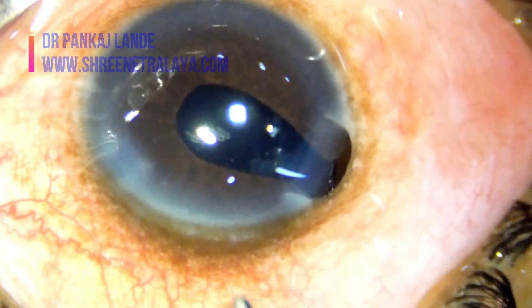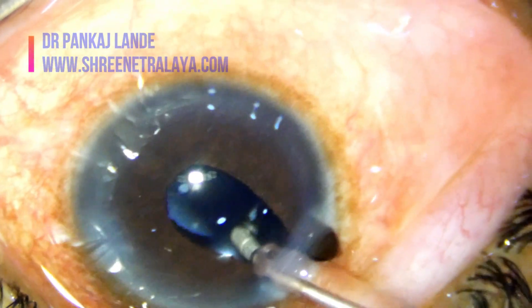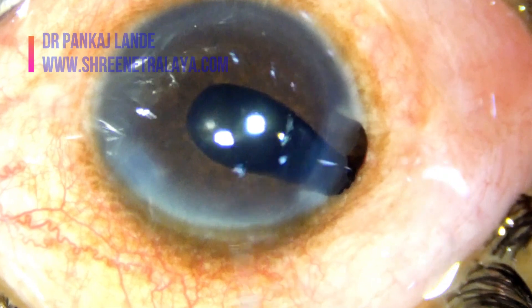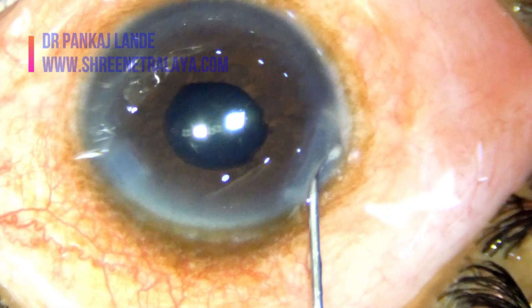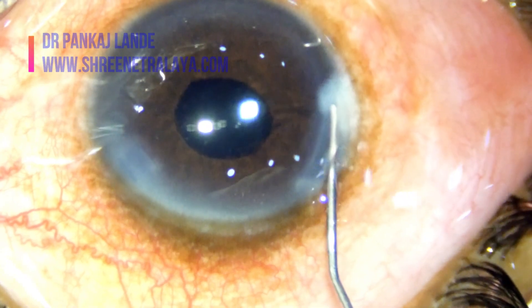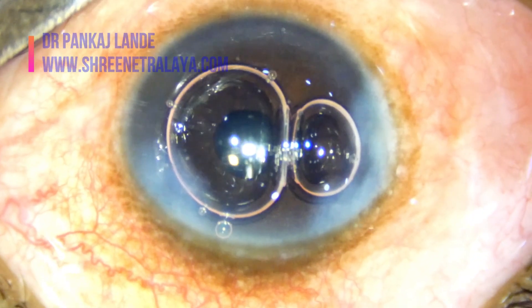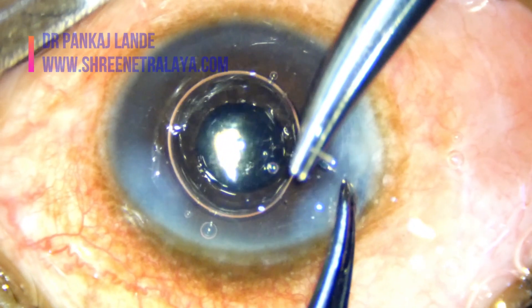Notice the iris is prolapsing out of the incision, so I am doing a iris repositioning. I am going to put one suture as that will prevent any anterior chamber leak in the post-operative period. Do use a suture if at all needed for surgical wound closure. These sutures can be removed after a week's time.